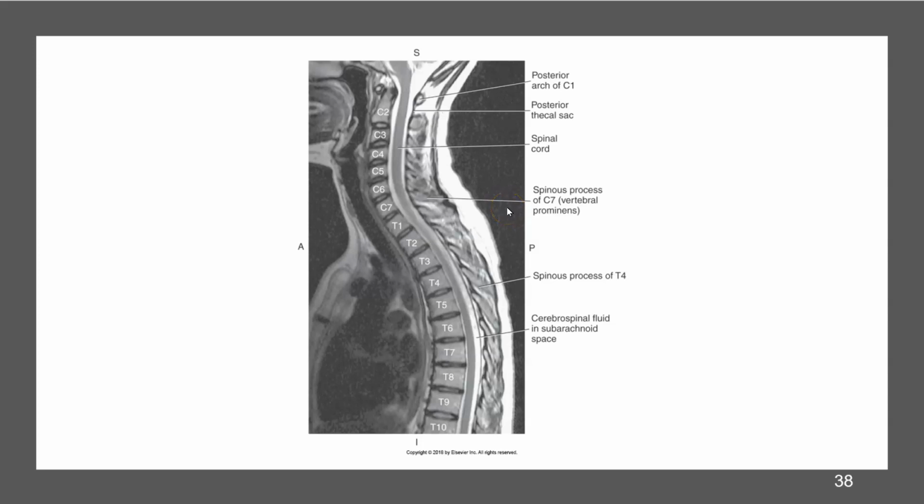This is a sagittal T2, and we run the scan quite a bit, especially when we're scanning to count. We'll actually open up a little bit bigger when we're doing a T-spine, because we have to be able to count. Usually we count from the top down, but there's times where we count from bottom up. If the C-spine is too fused and it's hard to count, then we'll count from lumbar up. So we'll go L5-S1 all the way up.